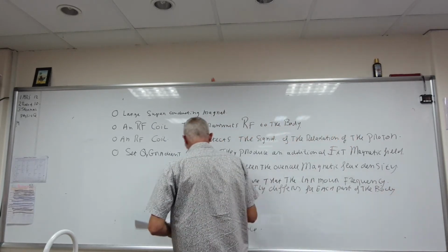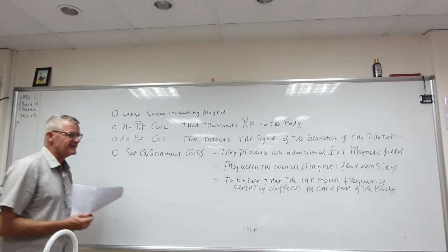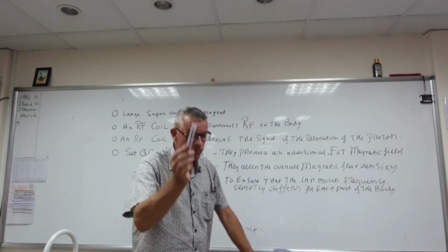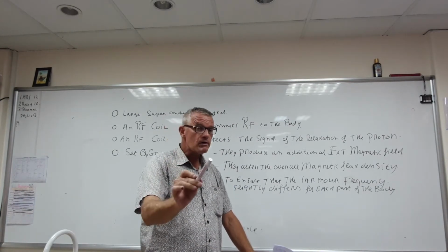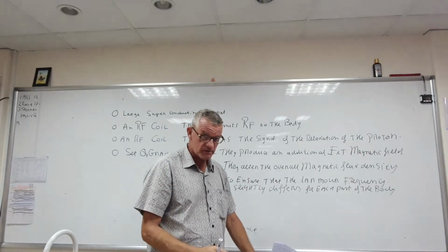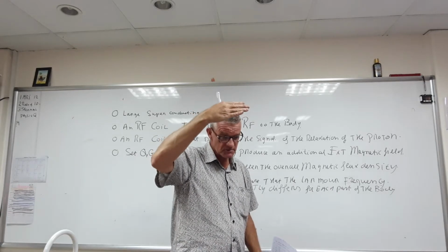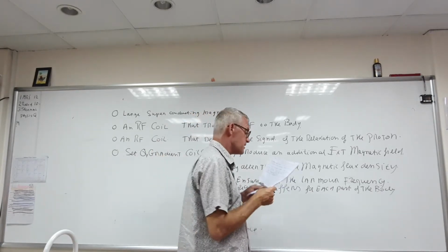That means that not at all places they have exactly this resonance frequency. And we want to have this resonance frequency only for sections of the body, okay? Because the MRI scanning is only going to do section for section for section for section, yeah?